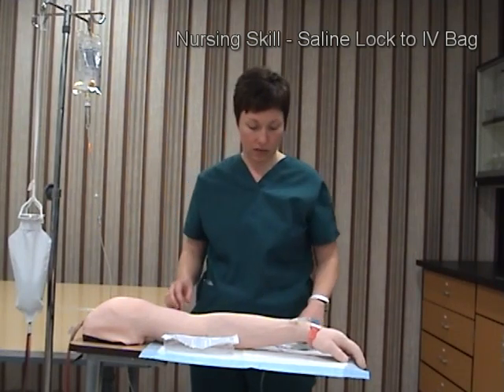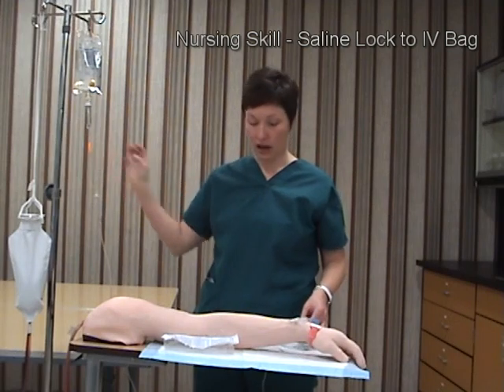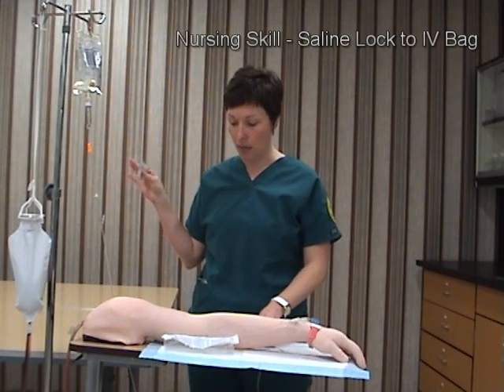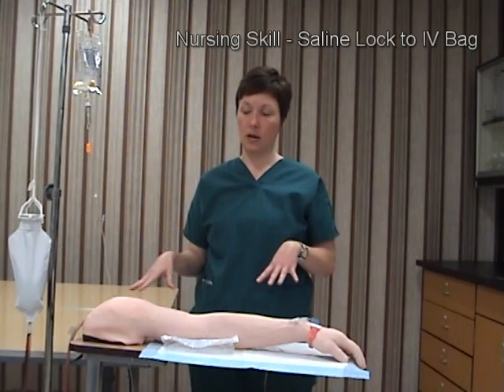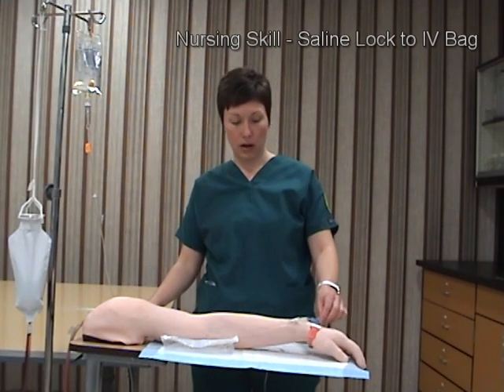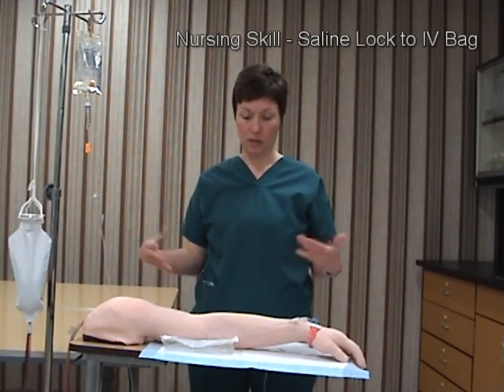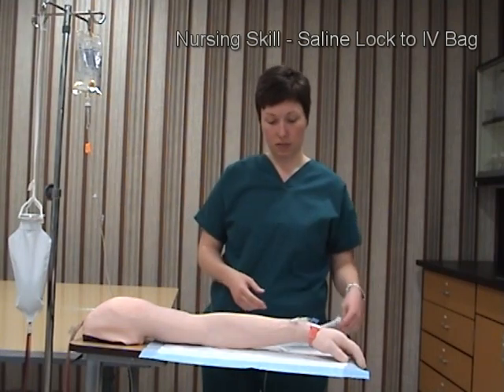I will verify that I hung the right solution and double-check that I have the correct label on the bag, properly signed and dated. I will make sure the patient's bed rails are up, the bed is down, and the call light is within reach. I'll assess to make sure the patient is not experiencing any pain, then gather my supplies, wash my hands, dispose of what I can, and leave the room.